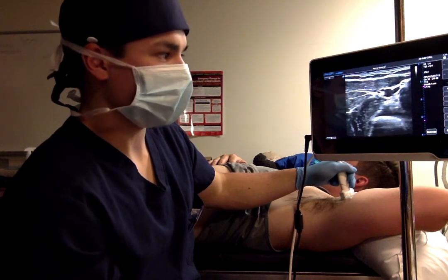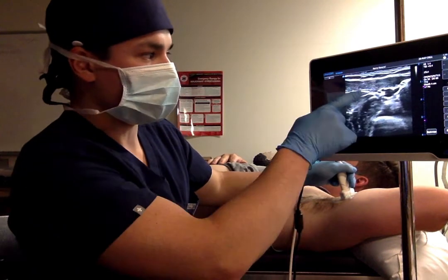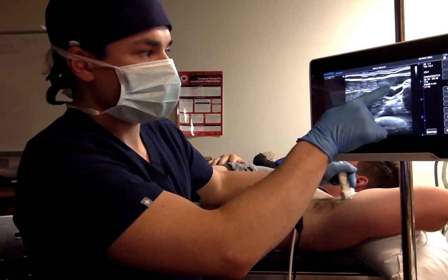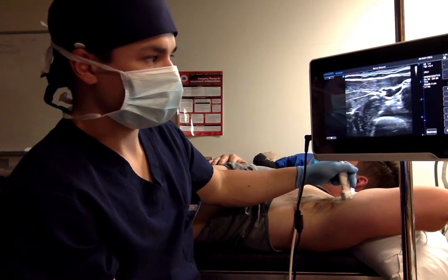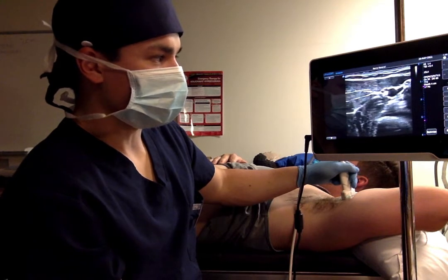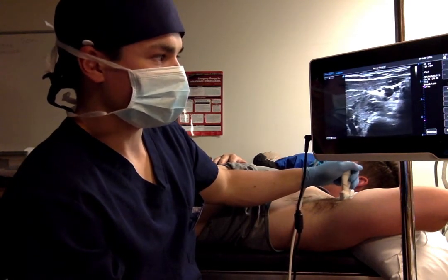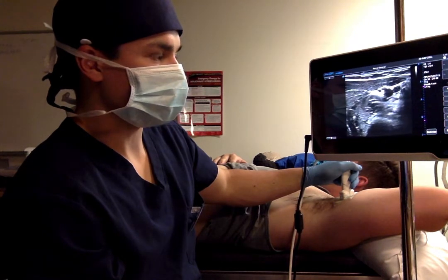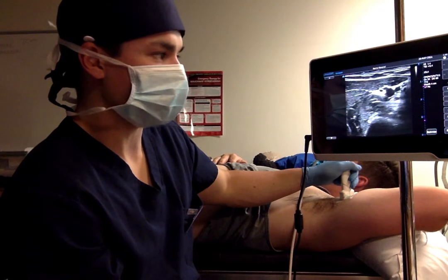So we aspirated, injected our 0.25% ropivacaine, and then withdraw our needle and redirect superiorly towards the median nerve. And once again, use the nerve stimulator if you feel like it to a goal of 0.3 to 0.5 milliamps and get a finger twitch, aspirate, and then inject the remaining 15 cc's of 0.25% ropivacaine.